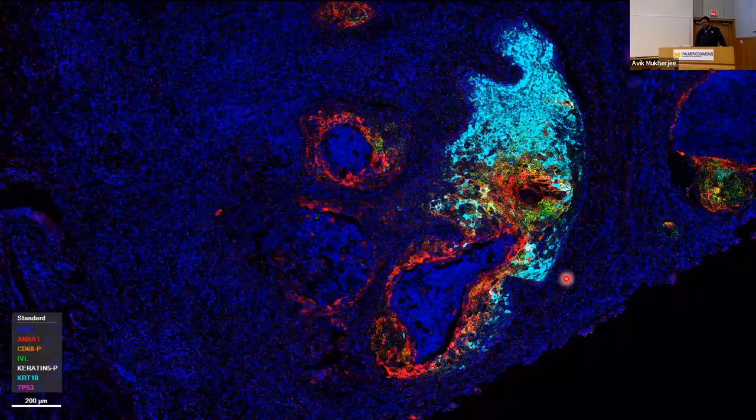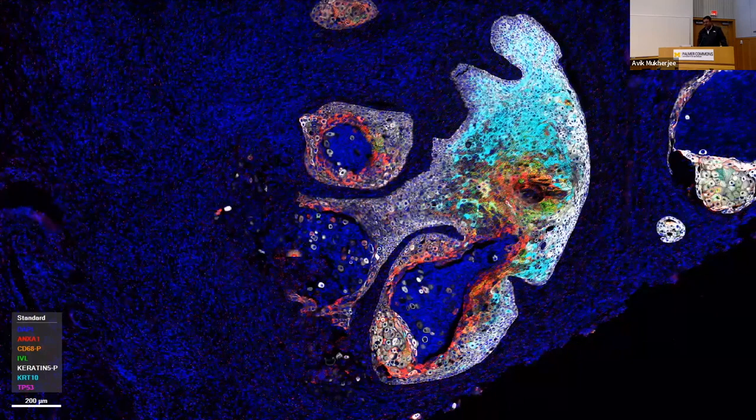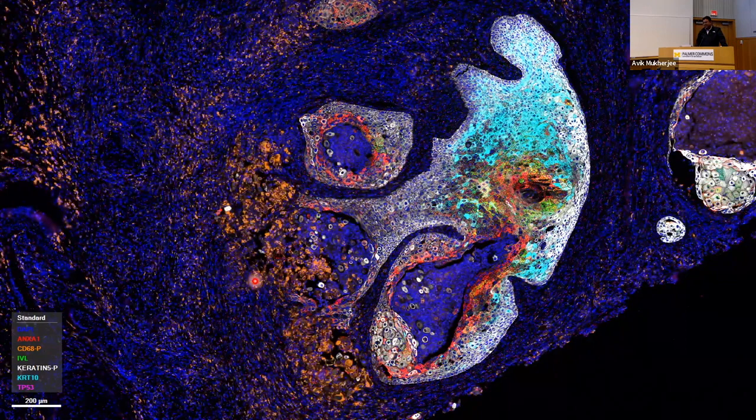But when we look at region 3, we can see there are portions here that are chewed up. And if we put the keratin 5, you can see something is happening in this region. To understand it better with the RNA and protein, if we add a protein like CD68, you can see there is some new biology waiting there to be discovered. So when you're looking at this kind of multi-omic approach, it would be important to understand these images better by looking at the chemokines, cytokines, and the proteins together on the same tissue.